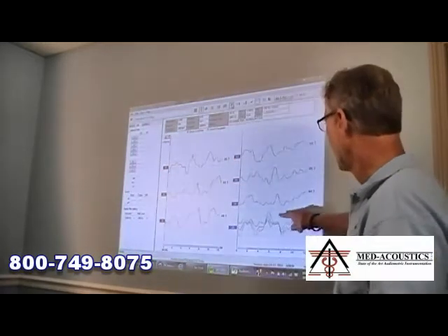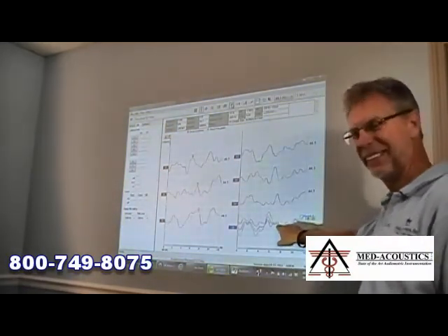It's really a smart way of doing it. And so here's my 40 dB response. Let's see if that replicated. Sure did. So I have automatic replication without me doing it. Here's my 20 dB response. Okay, did that replicate? Yes. Pretty nice 20 dB response. Okay, and acquired within just a few hundred stimuli rather than a couple of thousand or more.